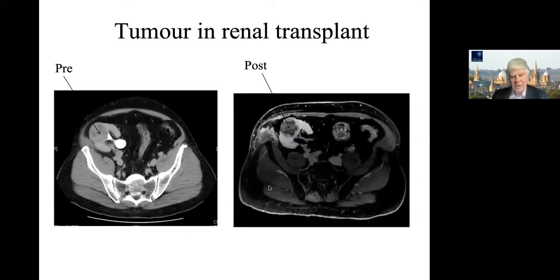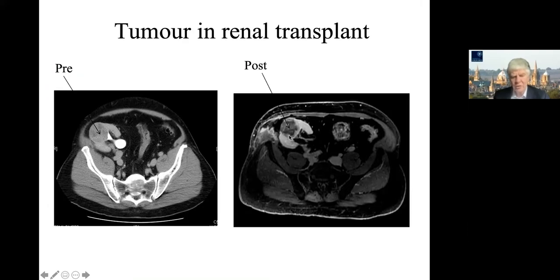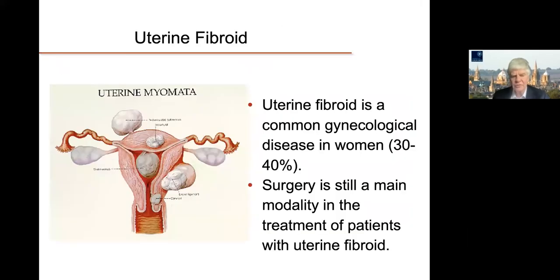Now, with a kidney transplant, as you are probably aware, when you take a kidney out for transplantation, you remove the perinephric fat and you put it in the groin, so the ribs are not in the way. And we have had 2 patients with a tumor in a renal transplant, which we have treated with HIFU. And here is one of them, about a 4 centimeter tumor. And after treatment with HIFU, we had 90% ablation of the tumor. We did then remove the tumor, and there was a little rim of viable tumor left, but 90% of that had been ablated. So in a transplant, it does work much better for the kidney.